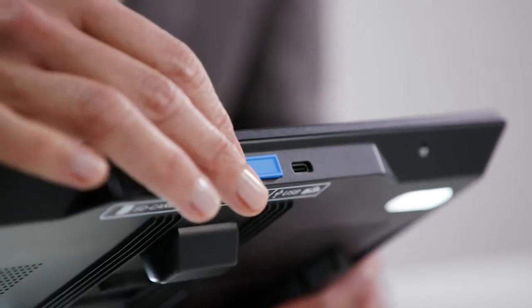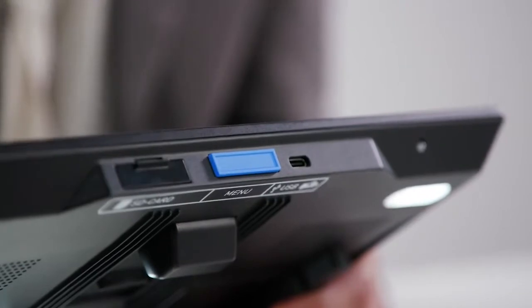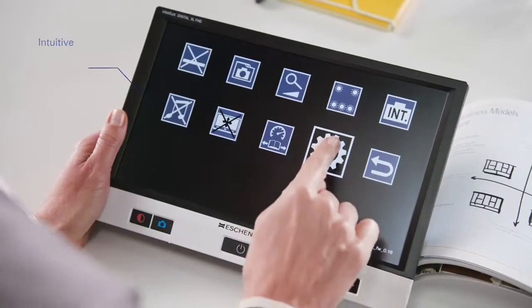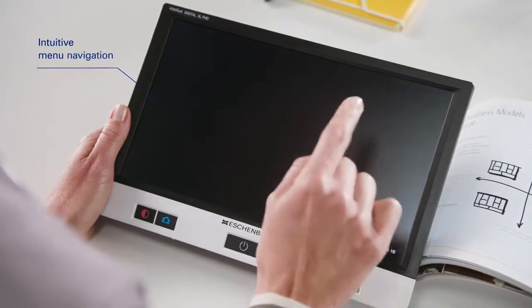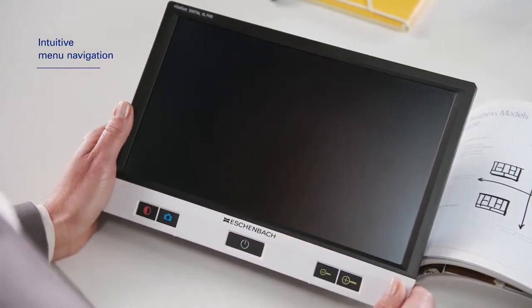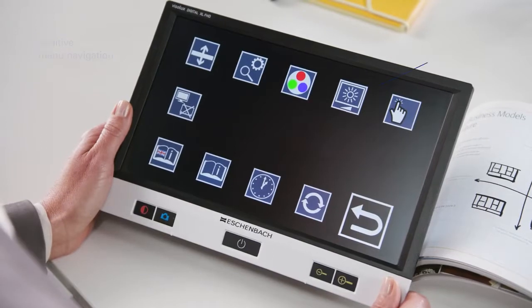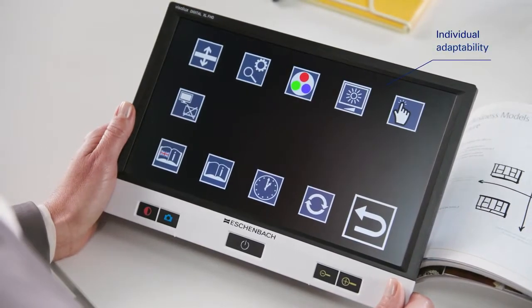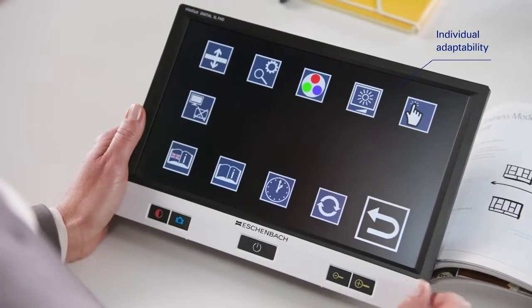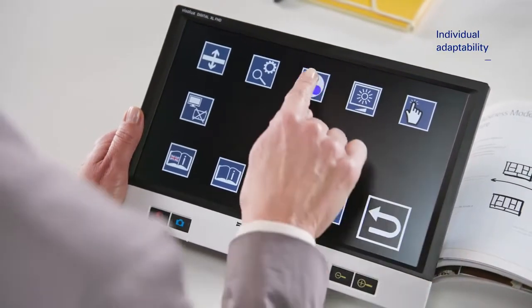Personal customization options allow you to switch the touch screen, photo function and voice output of the menu navigation on and off at any time.